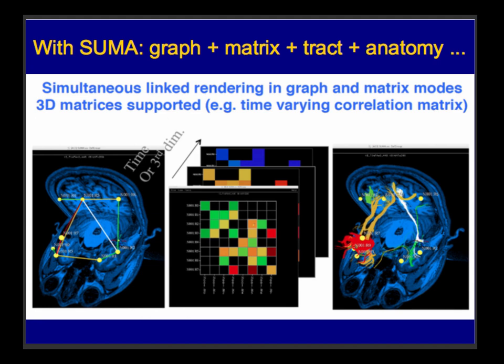So if I have regions in the brain and I want to correlate them with each other and I can measure that. So let's say if I have 8 regions in the brain, I can calculate correlation with all the other, well, with the 7 other parts of it, and I can make it look like a correlation matrix. So this represents regions 1 to 8 and 1 to 8. And so along the diagonal, it's a property with itself, but on these off diagonals, this is a property that relates between, say, region 1 and region 8.